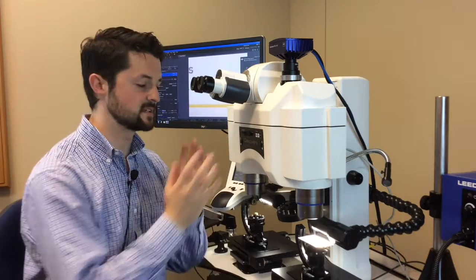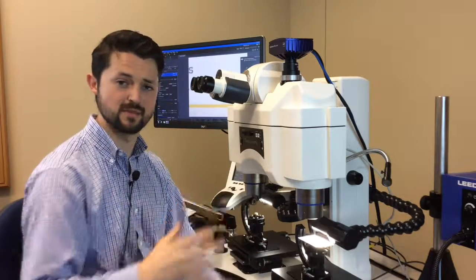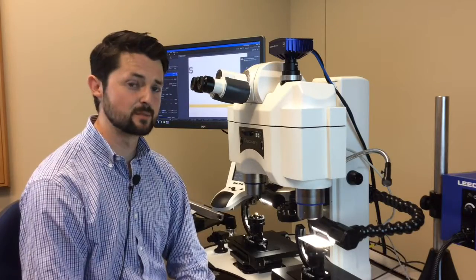The idea here is now whenever I sit down at the microscope, I can dial in my diopter numbers, and when I focus at high power and go to low power, the image will remain in focus, as will my dividing line, as well as my camera. Hopefully this helps find your diopter numbers.